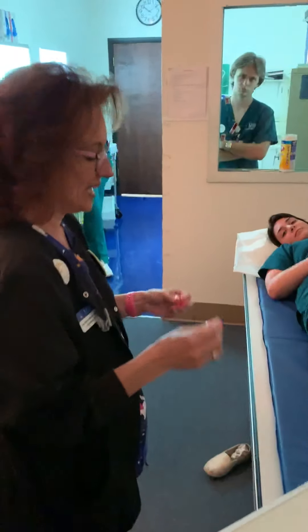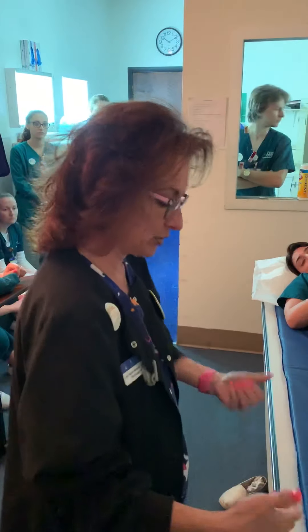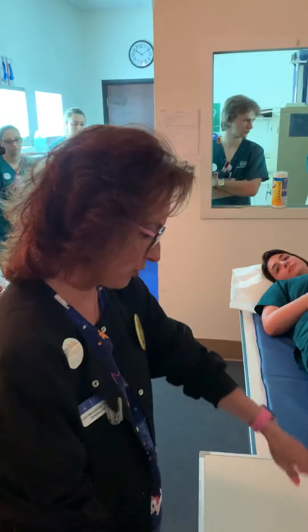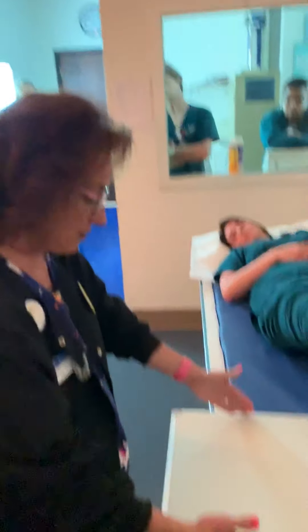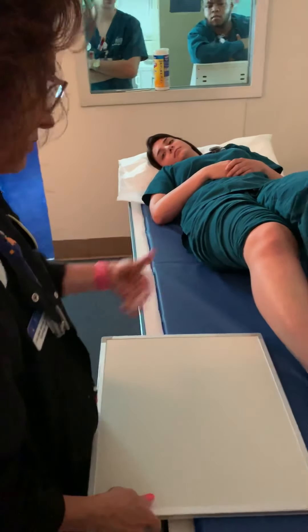That's not really an issue because you would have it tabletop. Most of the time you're going to have something similar to this — all four corners would be blank, but you're probably going to end up going corner to corner on most adults. For a pediatric patient, they might fit just with the IR portrait or lengthwise to the part.